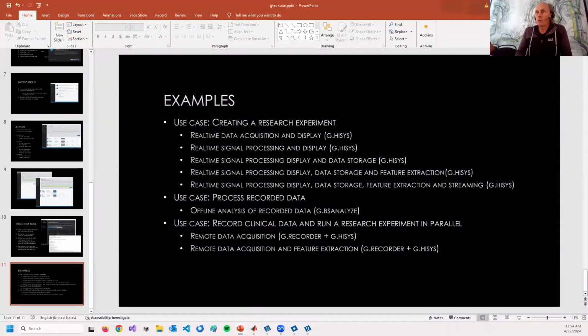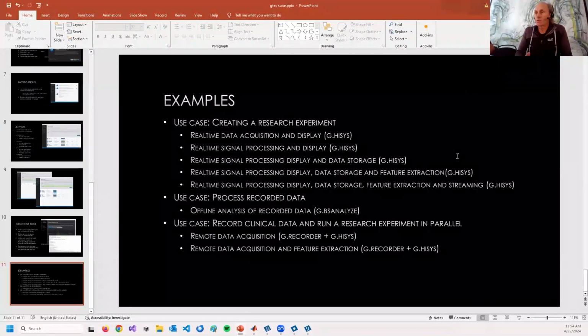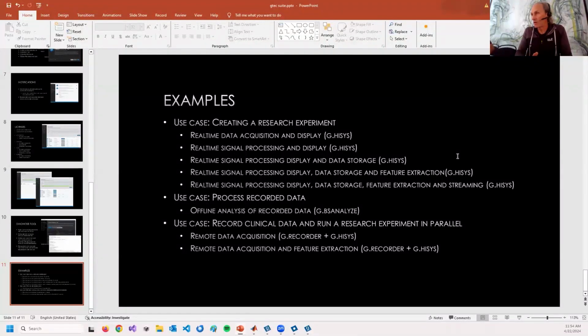There's a question from Manuel. Can you use g.tec also in embedded real-time applications?